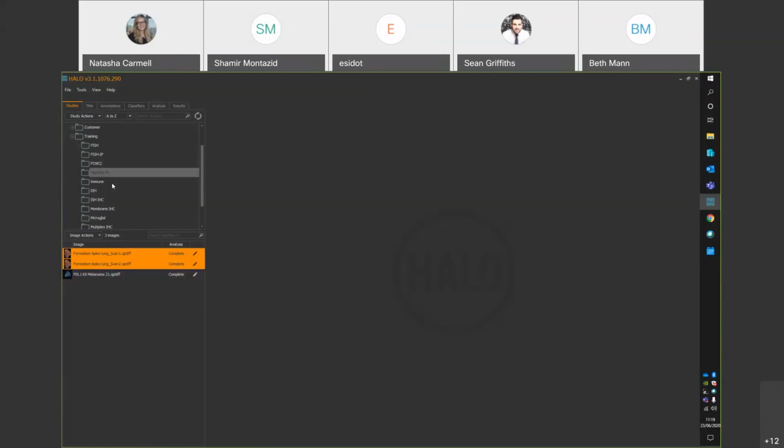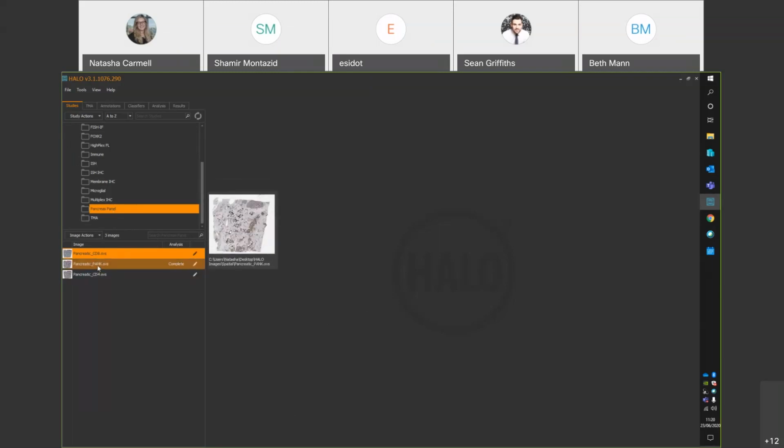So the next thing we'll look at is registration. But again, I'll just pause to see if we have any questions. Okay, so we'll go ahead and move on then.